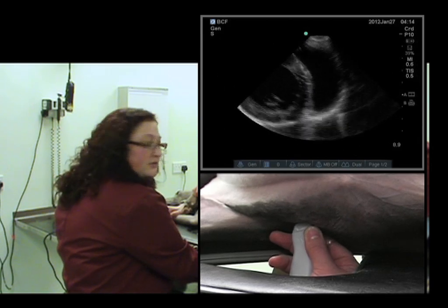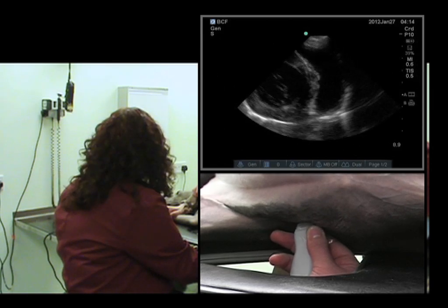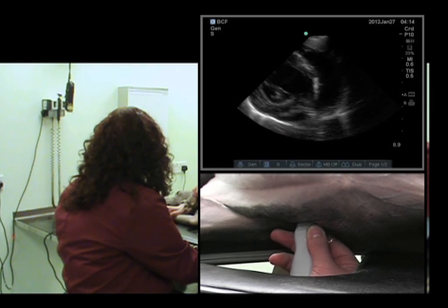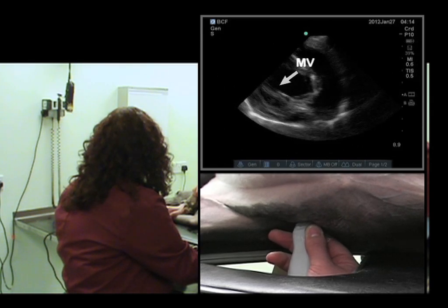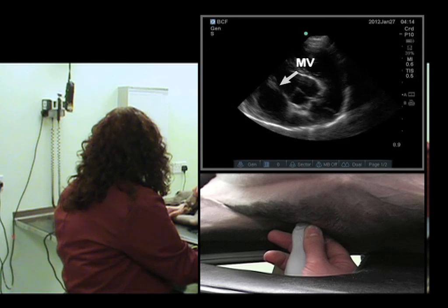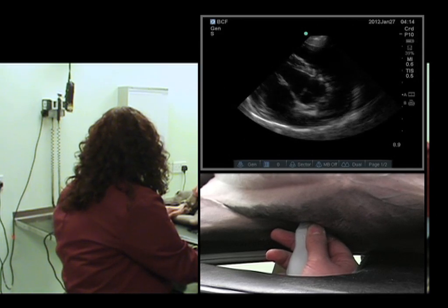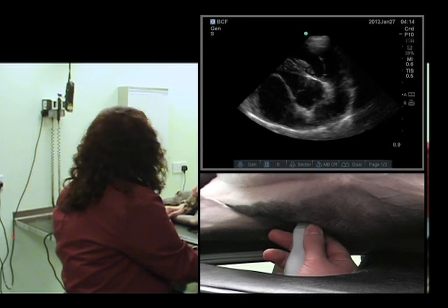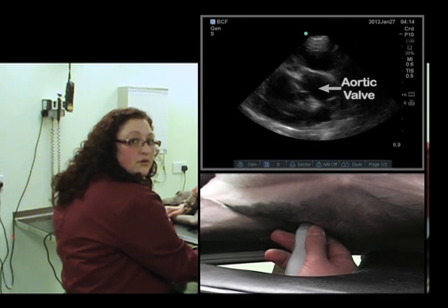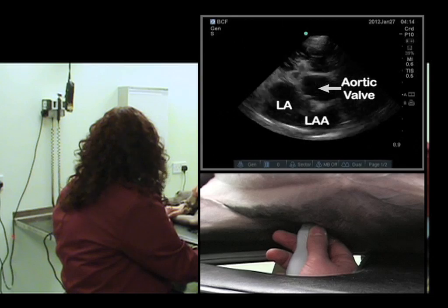We will then start to fan cranially, we will see the fish mouth come into view, and then also the aorta and the left atrium.